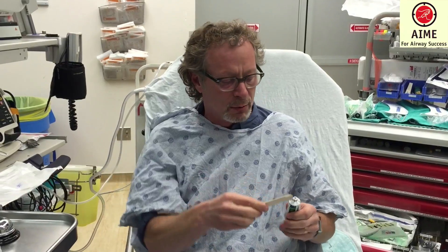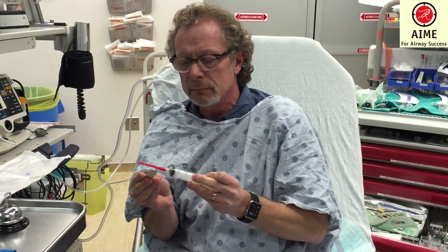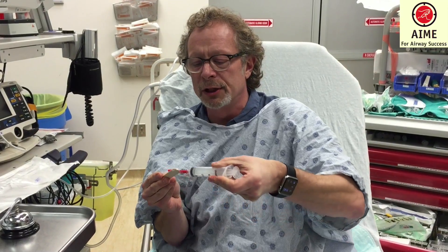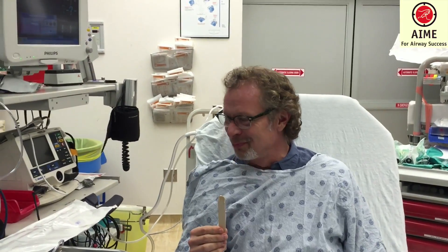You have to be very cognizant of the fact that when your upper airway gets anesthetized, some people get very anxious — they don't feel as if they can have a coordinated breath. I don't feel that way so far, which makes me nervous I'm not topicalized enough. I'm going to go in a little bit at the end of the tongue — that's the really gag-sensitive area — and then we should be ready to go. I can tell it's working because I can't feel anything when I'm applying this right now. Nick, I'm going to get you to set up a scope for me.